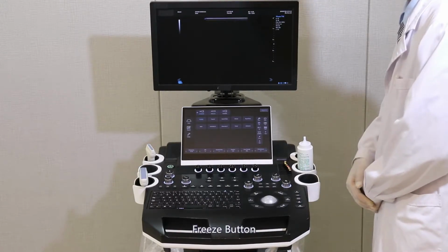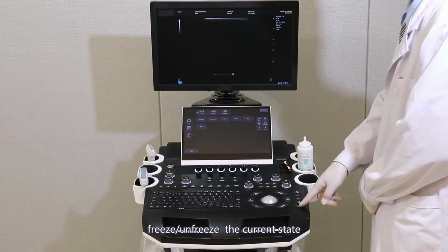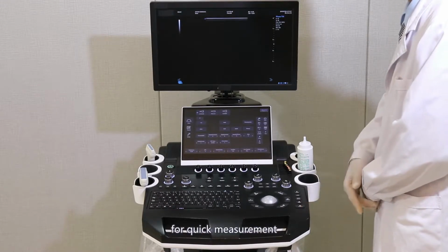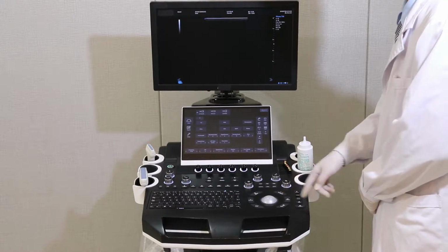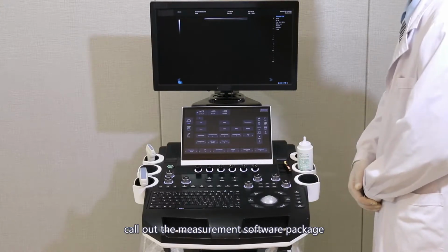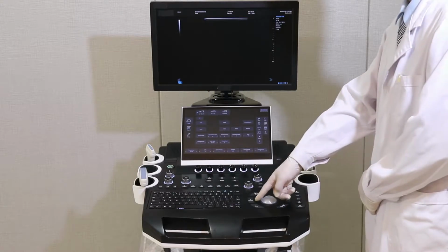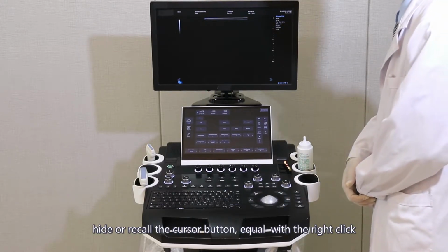Freeze button. Freeze and unfreeze the current state. Caliper. For quick measurement. Calculation. Call out the measurement software package to select. Cursor. Hide or recall the cursor. The button is equal to the right click.